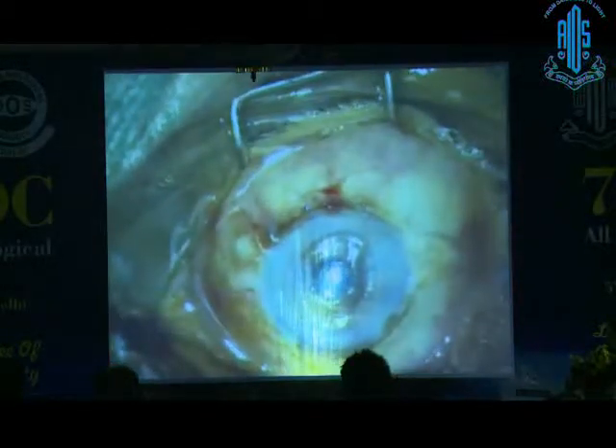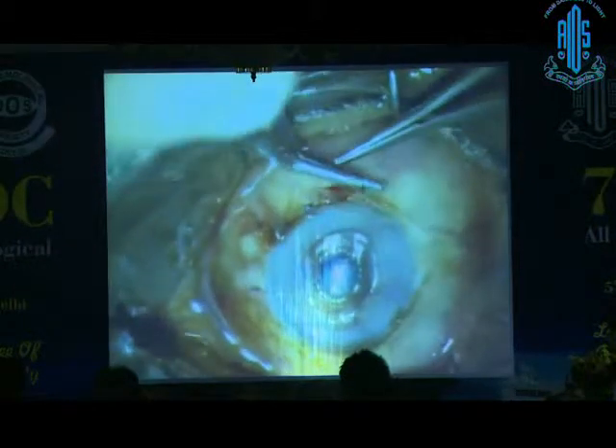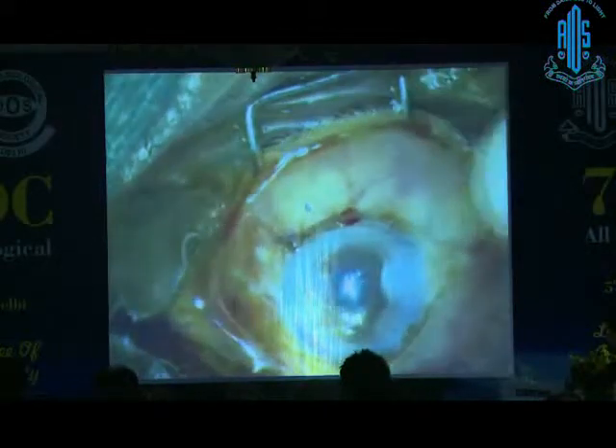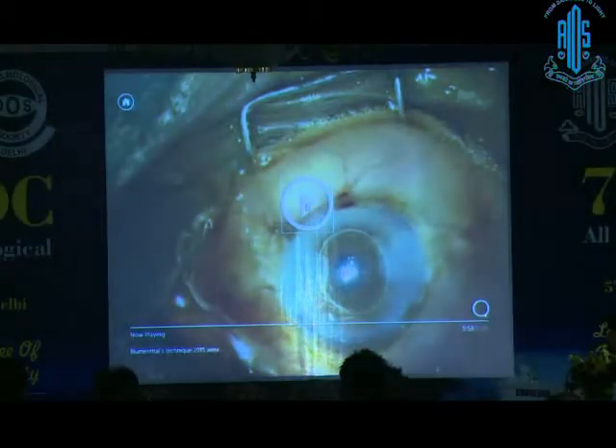We will make a bleb-forming suture going from the conjunctiva to the cornea. You put a kind of a mattress suture through the conjunctiva and through the cornea, and you can see the bleb form right on the table. Once you put this suture, the bleb is formed right at the table.